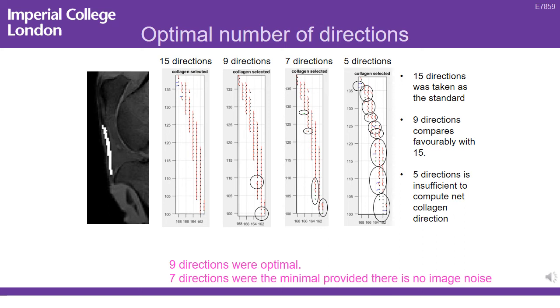You'll notice in the 15 directions that there's a couple of voxels shown towards the edge, and this is due to the blurring that tends to happen with the registration and alignment. The more directions and volumes that you need to register.